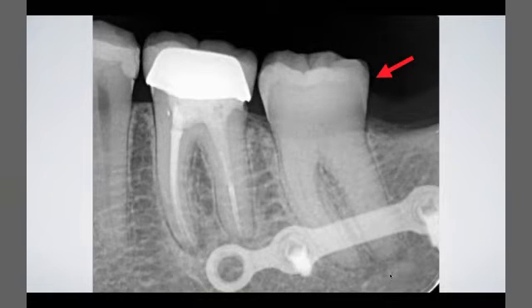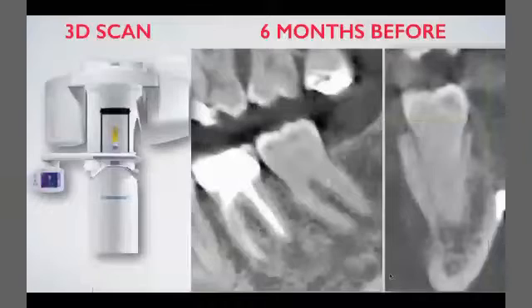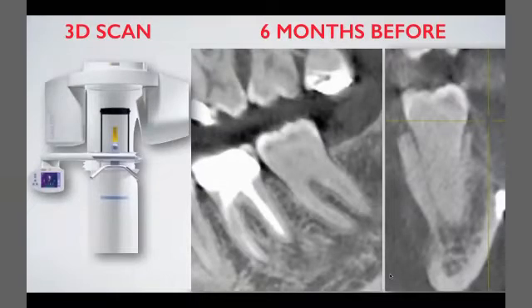A vitality test for sure is not a valuable test for calcified teeth because the pulp chamber is calcified, so the test is useless. I told the patient I couldn't see any problem, but when I checked her file in our center's system, I saw that she had a CBCT done 6 months before for an implant on the upper right area. I checked the cone beam for this patient and found everything perfect, no periapical lesion, and everything is going well.